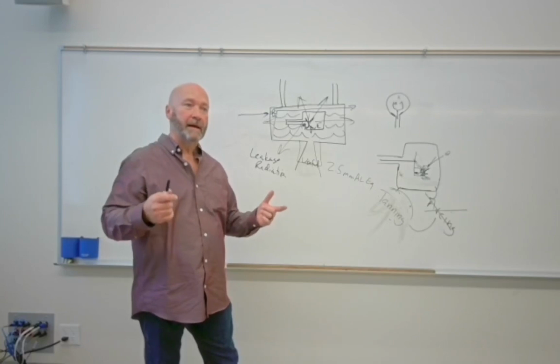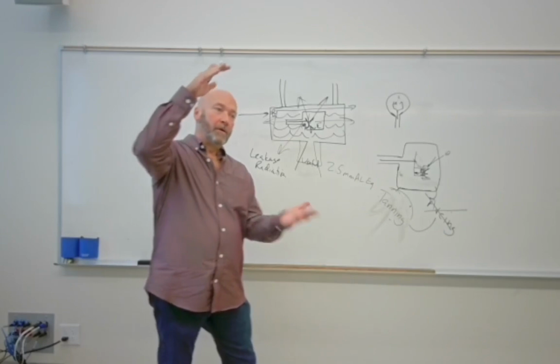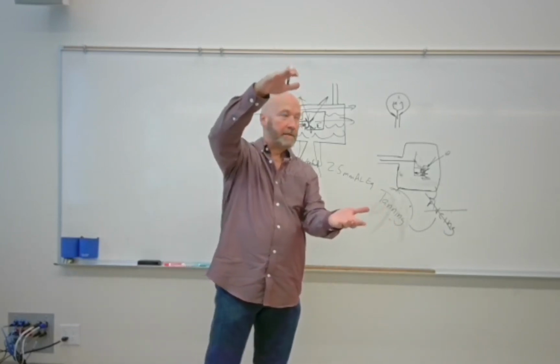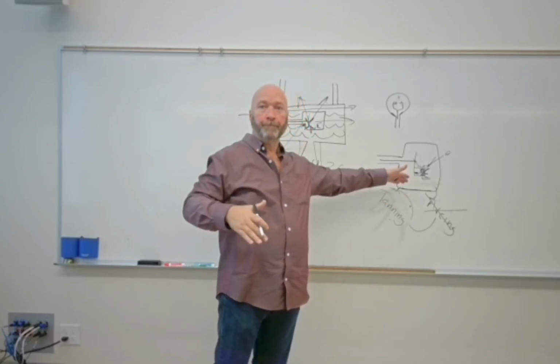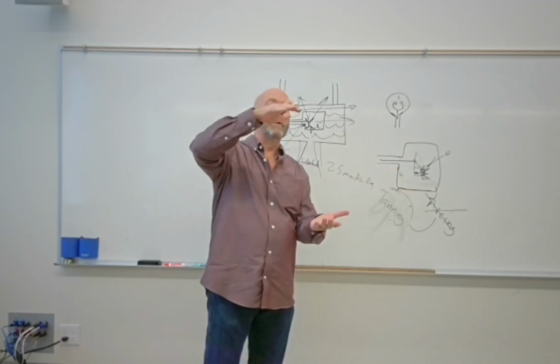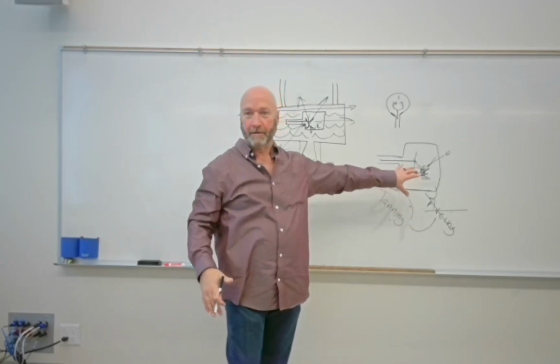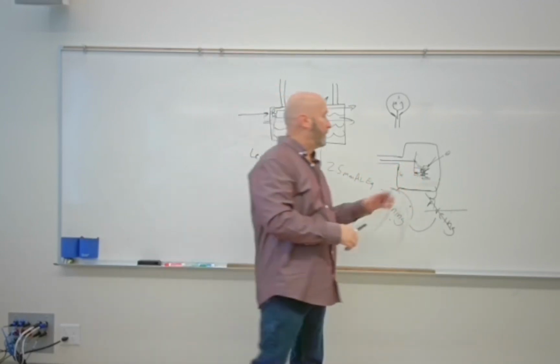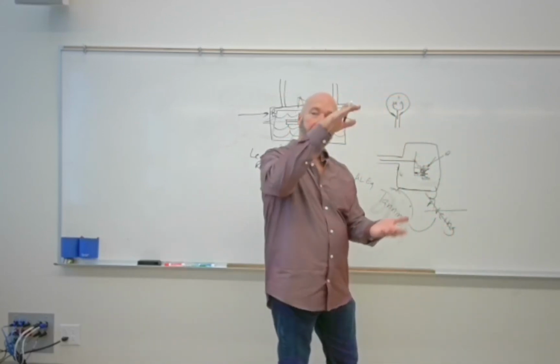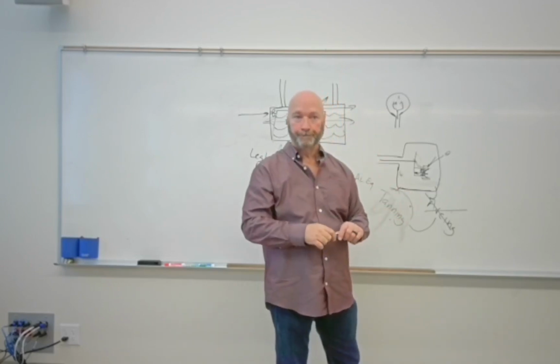Now, the purpose for that is just like the purpose for the large and the small filament. So if we have large filament and we send the electrons across the tube, they're going to interact in a large place on the anode, right? So we've got fluorescent lights. If our focusing cup fails, it's even bigger. And again, we've got even bigger fluorescent lights. If though we use the focusing cup and we press them together, and especially if we use small filament, now we've got something more like incandescent lights and we can bring out sharpness or recorded detail.